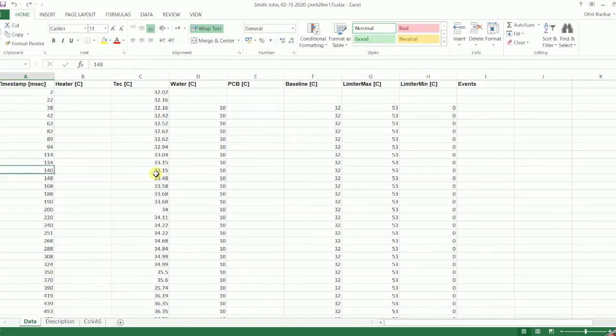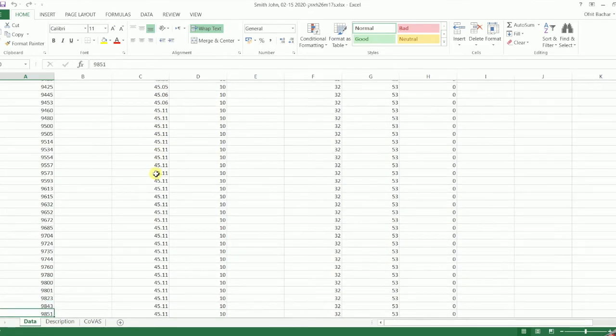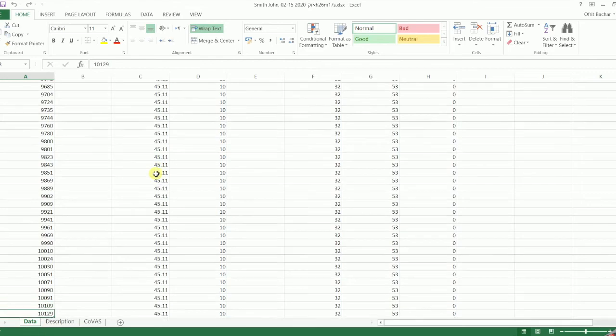We can see the temperature rise. And then you can see in a little while, because it's in milliseconds, you know, in a little while, you can see the changes that will happen as soon as I press the yes button.